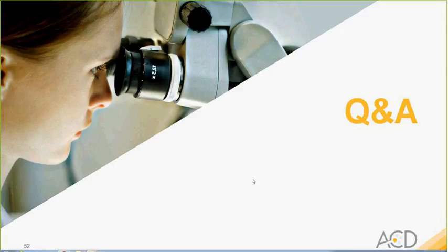There are a variety of ways that the intensity of those dots can be increased, by decreasing the fixation time, for example, or altering the pretreatment conditions. And we can work with you on troubleshooting through our customer service group if that's something that would be of interest to the person submitting that question.